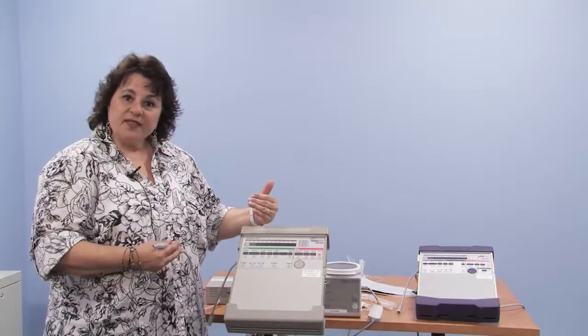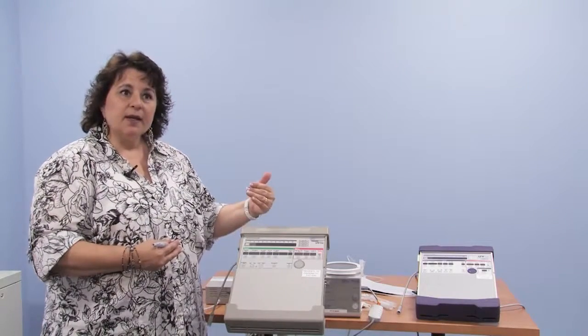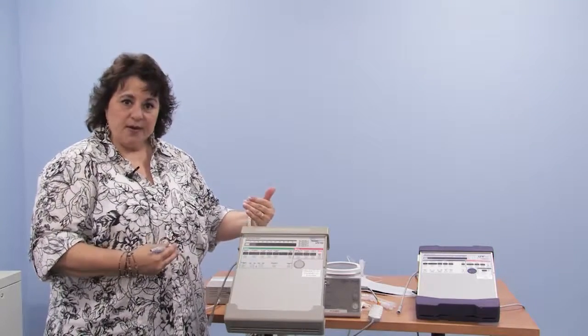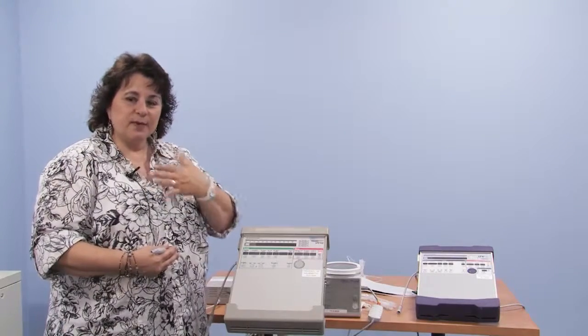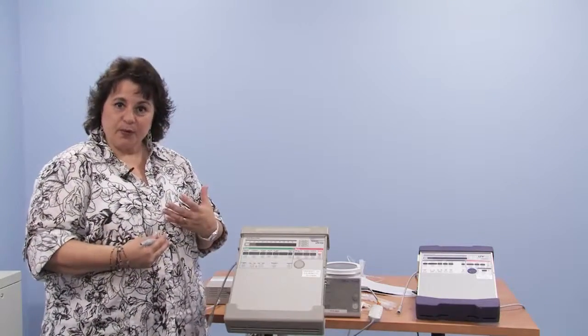In my opinion, what I've seen here is that this device, with its flow trigger capabilities, is very sensitive to the children's needs for a breath. So although it's cumbersome to have the circuitry up here and to have all those little hoses, this is the closest to the tracheostomy tube and patient in which your child's able to say, I want a breath in, and the machine actually senses that and fires a breath for you.